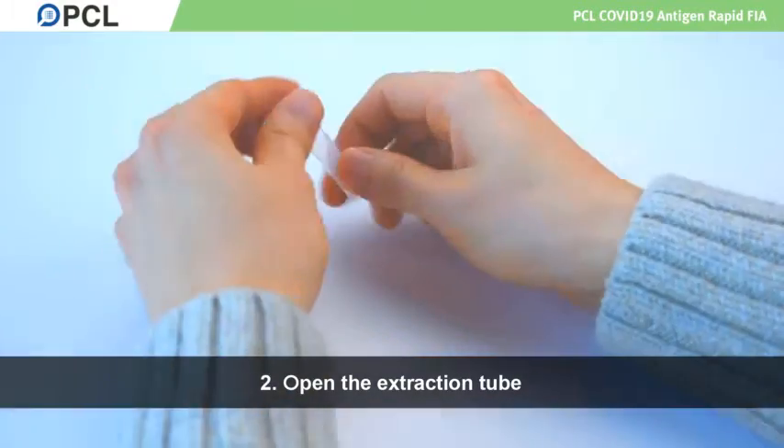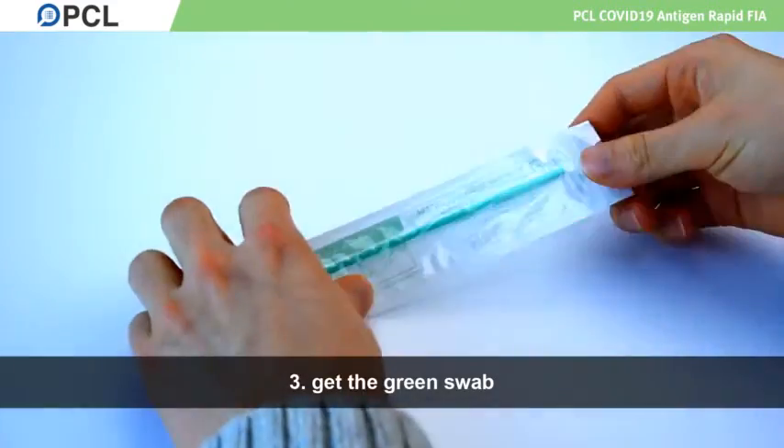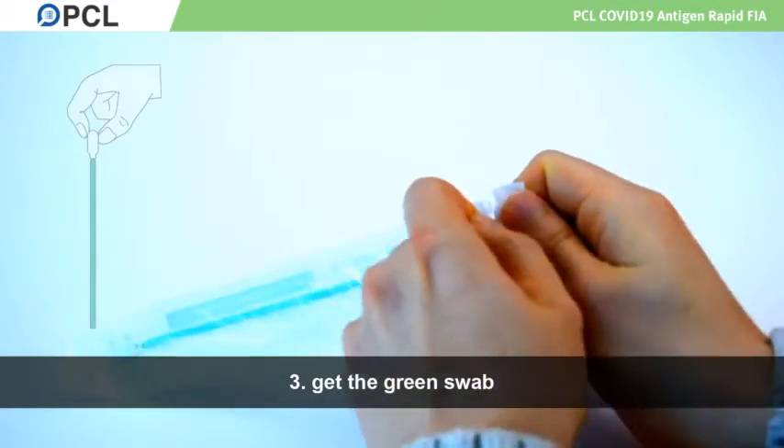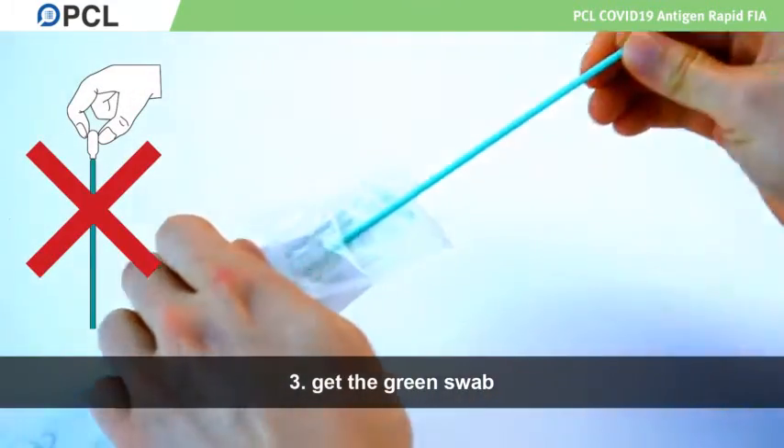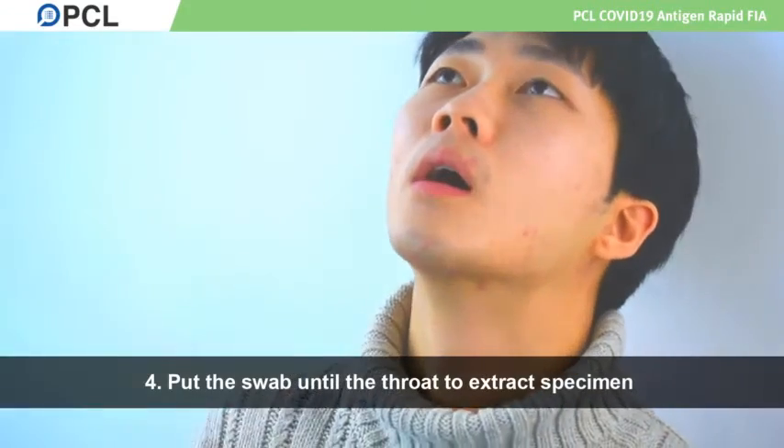Open the extraction tube and place it on a flat surface. Get the green swab, put it inside your mouth until it touches the throat. Rub it in your throat slightly to extract specimen.